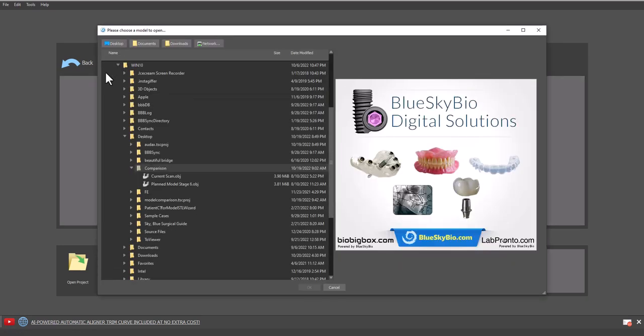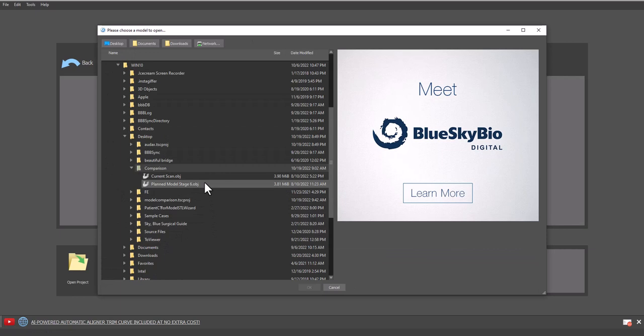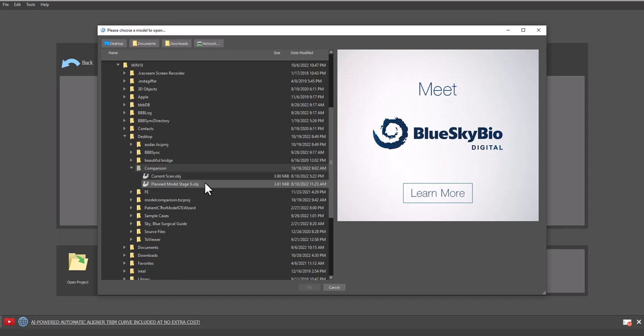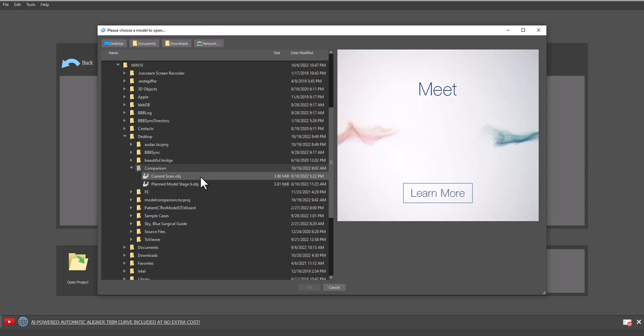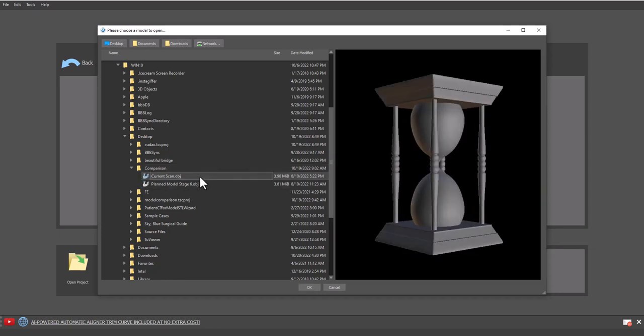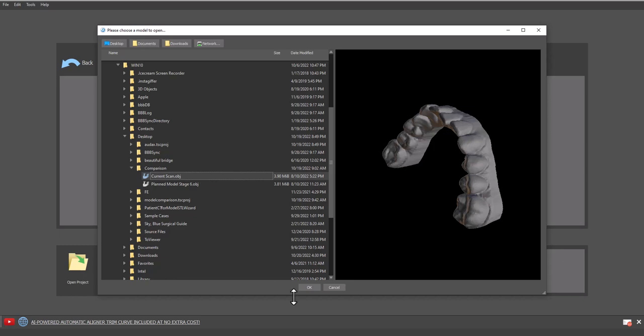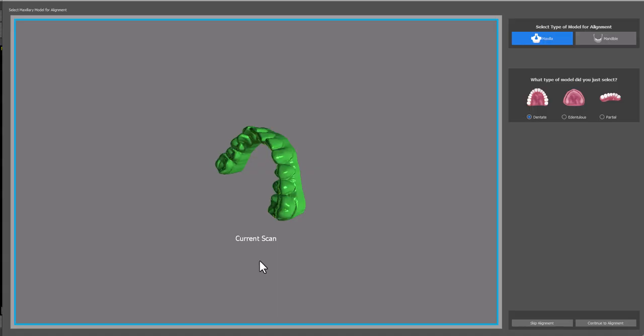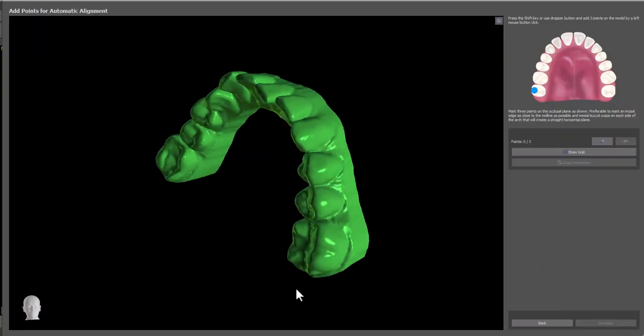I'm going to navigate the location on my computer where I have the relevant model corresponding to the relevant stage that the patient is at and the current up-to-date scan of the patient's teeth. I'm going to start by importing the current scan of patient's teeth by clicking on look at it. At this point, we're going to align the model to the relevant space. Do that by selecting the jaw type and type of model and clicking continue to align it.